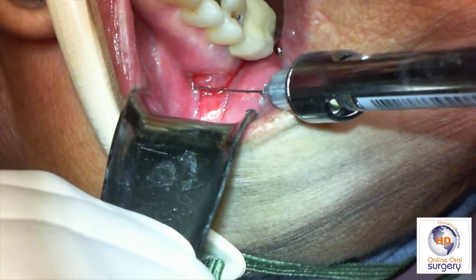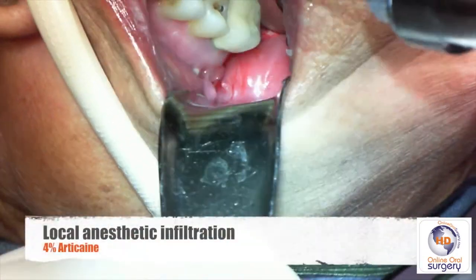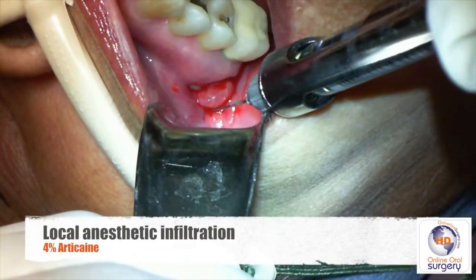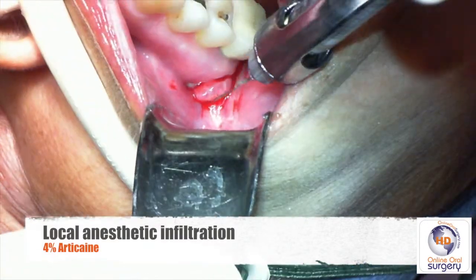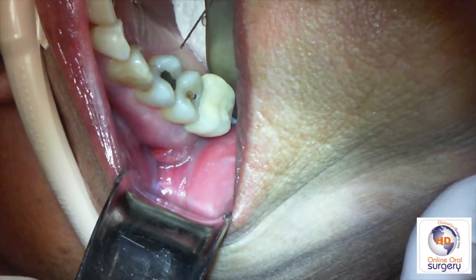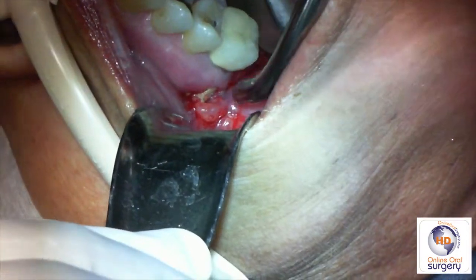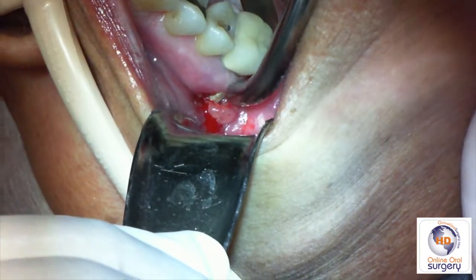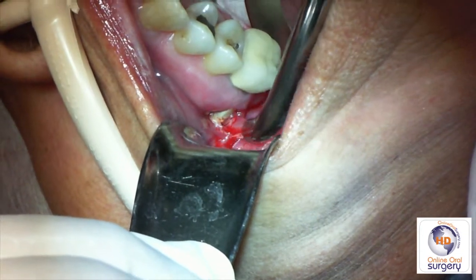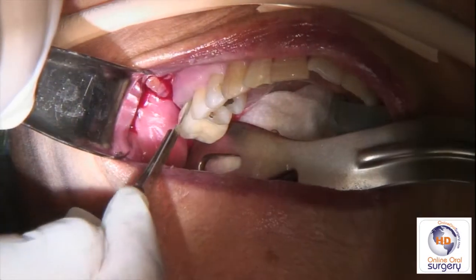We're going to start the procedure by giving some infiltration with a local anesthetic. My preferred local is 4% articaine — it penetrates very well and gives good profound local anesthesia. I'm going to infiltrate it around the tuberosity area, on the buccal and on the palatal. You can see here that little exposed bone underneath the flap of tissue; there is a lot of inflamed, friable tissue that's obviously going to need to be removed.